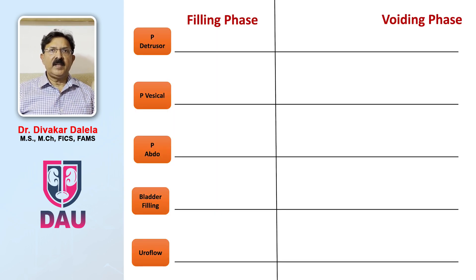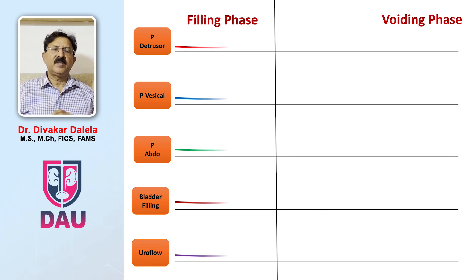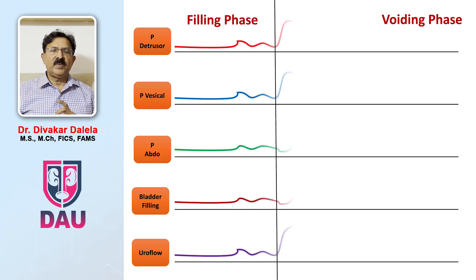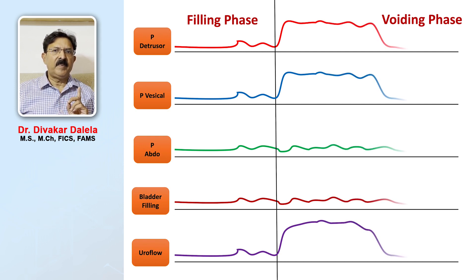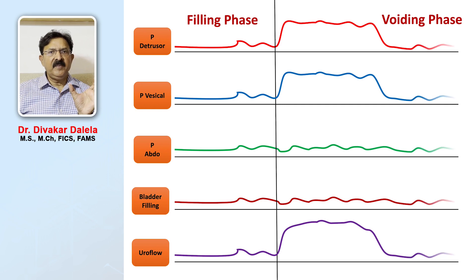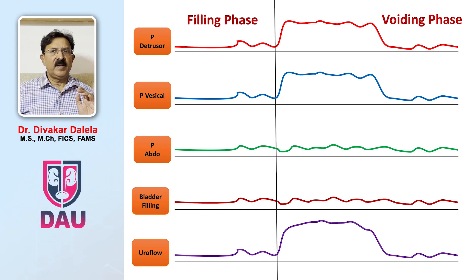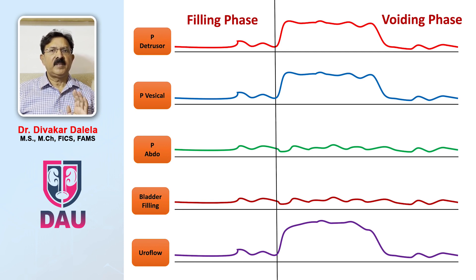Now, in this study you can see how the pressure lines are moving in the graph. As you give the command for voiding, you will notice that the pressure lines for detrusor and P-vesicle are rising, while nothing is happening with P-abdomen. This is maintained for a sustained duration and then drops. The pressure reached is not very high and the uroflow graph generated is an inverted U-shaped, normal bell-shaped curve.